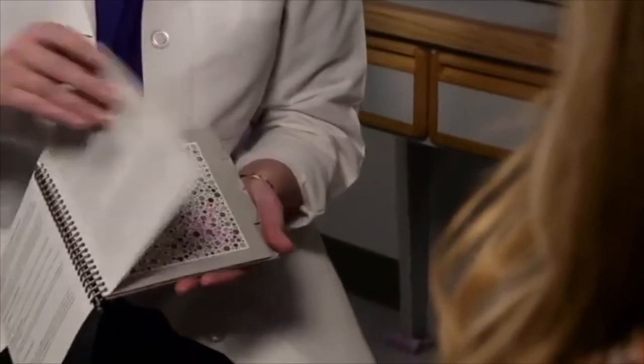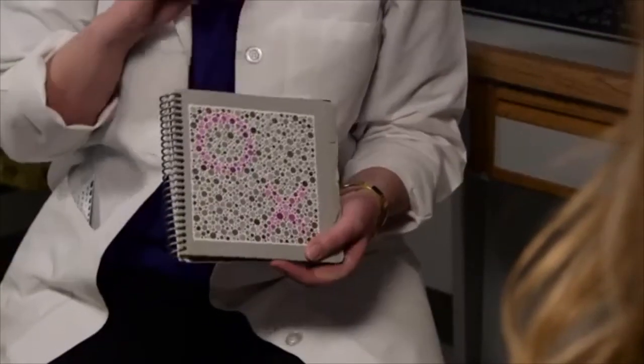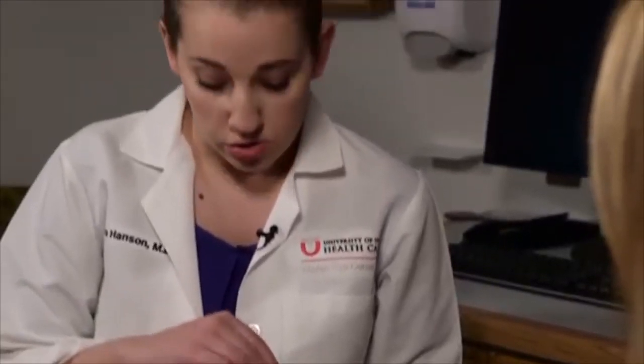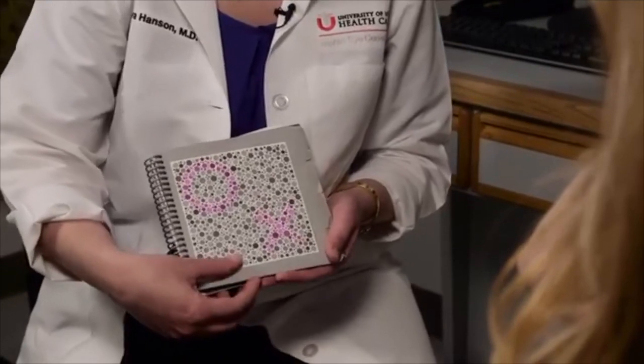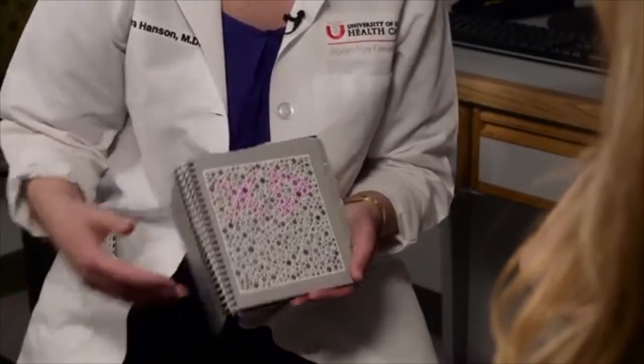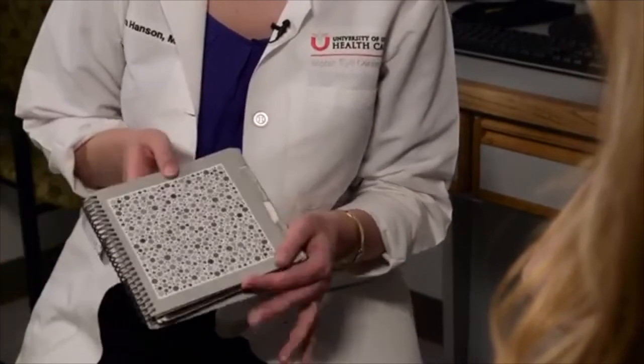So generally, you want to examine patients who have an acuity of around 20/200 or so. The test starts out with 4 different control plates. So you want to have the patient test one eye at a time. So can you go ahead and, yeah, that's perfect. We'll test your left eye first. So you ask the patient to describe what they see on the test plate. O, X. Good. So you go through all 4 of these. The 4th is a blank plate.